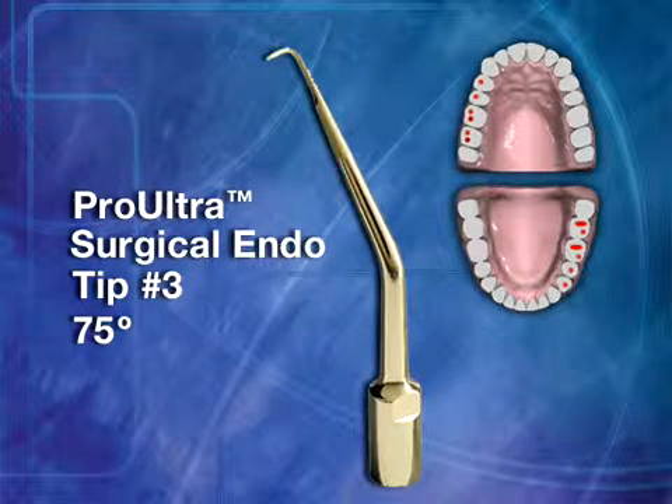Surgical Tip No. 3 has a 75-degree tip angle. This instrument is designed for use in buccal roots of mandibular left and maxillary right posterior teeth.